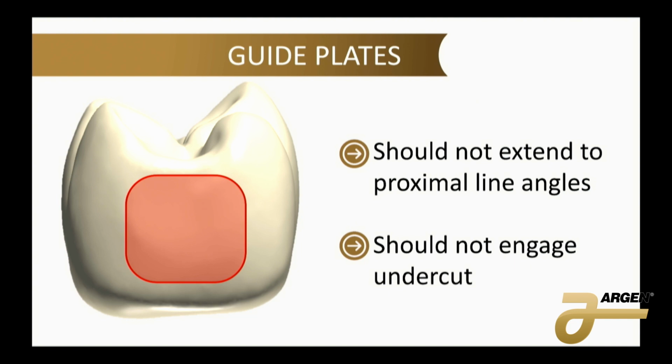What it's doing is it's allowing a surface for our partials to go up and down on. So these need to be prepped adequately. Otherwise, we just have this weird round surface that might have undercuts on it, and we're not making a good surface to slide these partials up and down on.